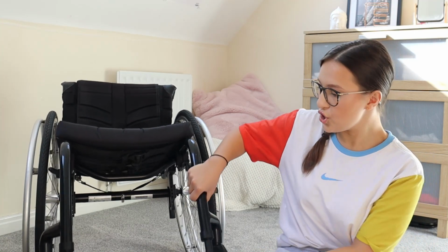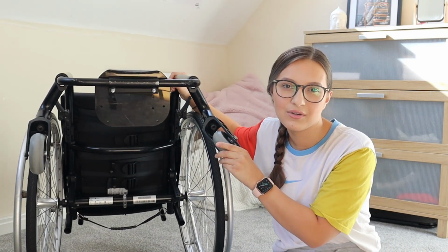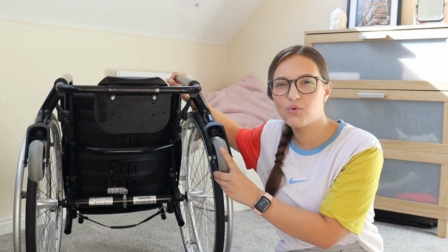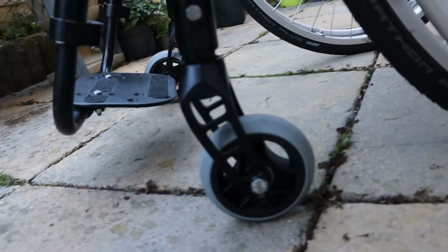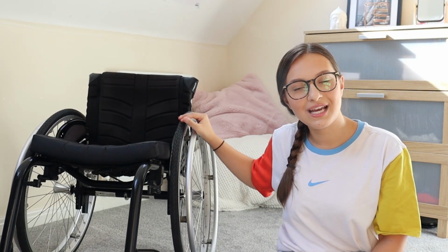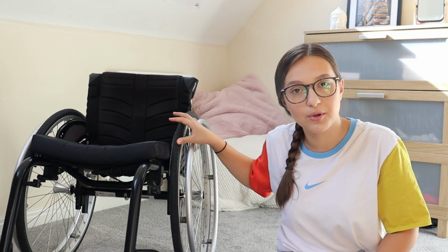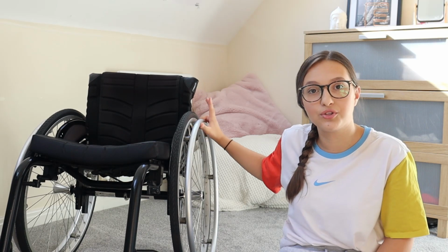Some of the things that we changed on the wheelchair were we bought new wheels on the front, as these small wheels were quite worn down, so I ended up paying something like £40–50 for new wheels and new bearings to go on here, which I didn't mind paying as I got the wheelchair at such a good price. I believe we put new tyres on it as the tread was quite worn down, and obviously you want your wheelchair to get as much grip as possible, so I do believe we put new tyres on it.